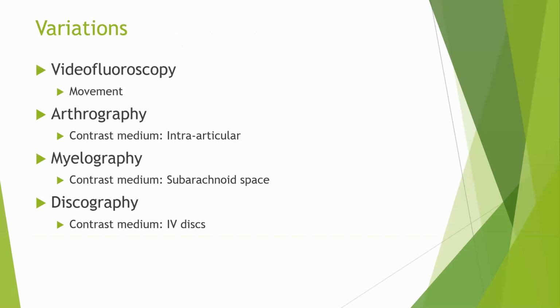All right, variations of x-rays. Obviously, in the first go, you can certainly do simple x-rays: go to a radio diagnostic center and get some images done. But it may not tell you the entire story. So there is something called video fluoroscopy.